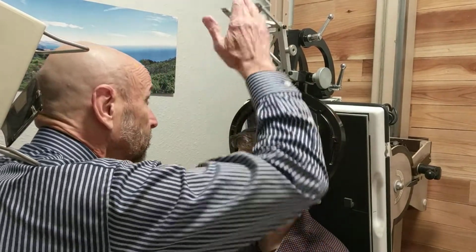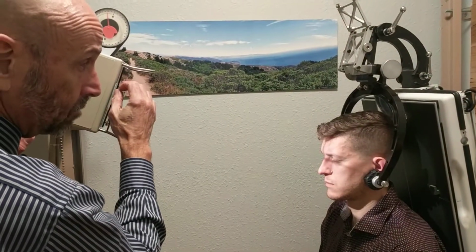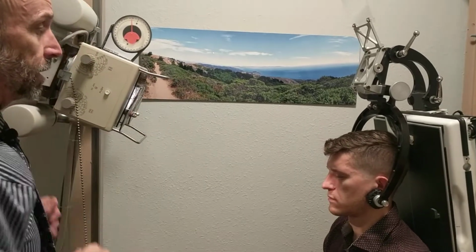So then we remove the face mask and, all right, close the eyes again for a second. And I always recheck to make sure that I'm on the same line that I started out with, and this looks good. So then the Nasium is ready to be taken.